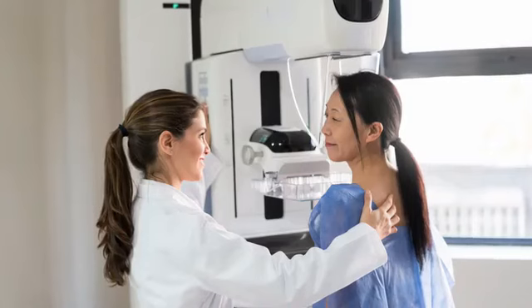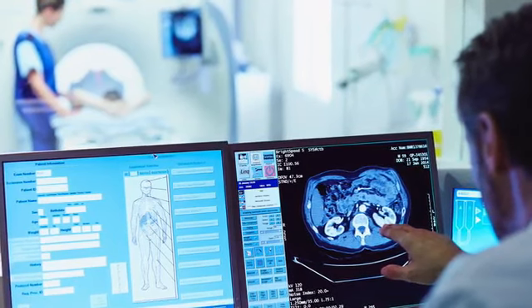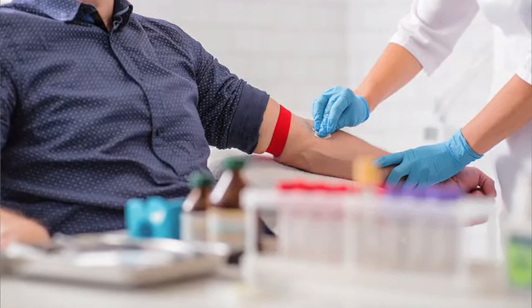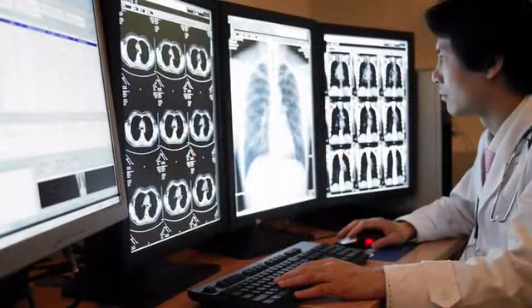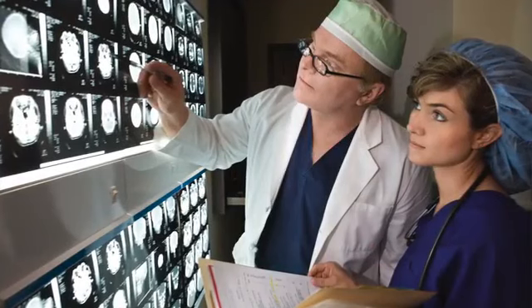It's also very helpful to ask the healthcare team in advance what you should expect during the procedure and once it is over. Knowing what will happen can help manage your stress as you wait for your test. For instance, some procedures require people to receive a special dye called a contrast for the test. This may mean that you'll need an injection before the test itself begins. When injected in your vein, the contrast dye travels through the bloodstream and helps create a clearer picture of specific parts of your body. Or it may be given as a liquid to swallow, depending on what part of your body needs to be scanned.